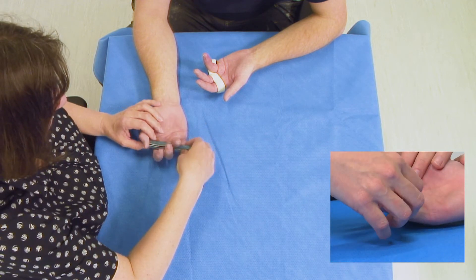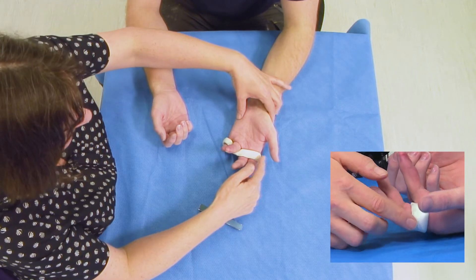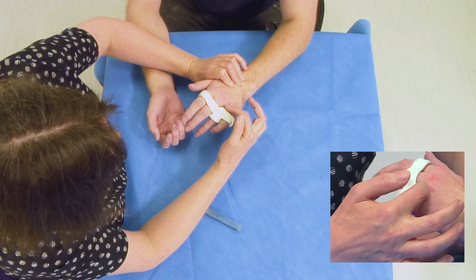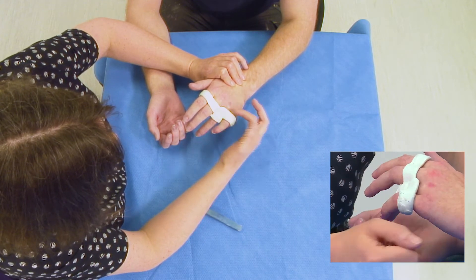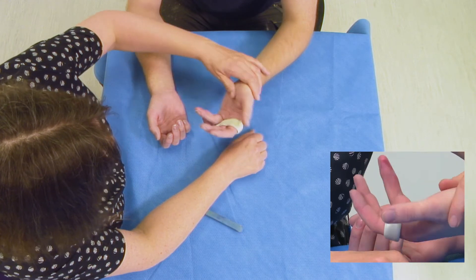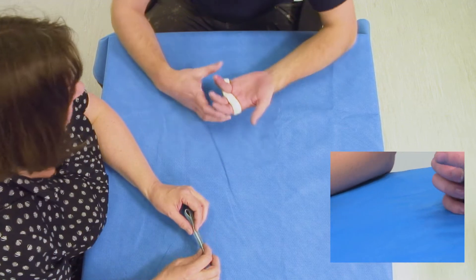If we move now to the injured hand, you can see the splint that's been applied — it puts the injured finger at that amount of relative flexion compared to the uninjured adjacent digits. I'll ask you to go through the exercises that you've been given to do.